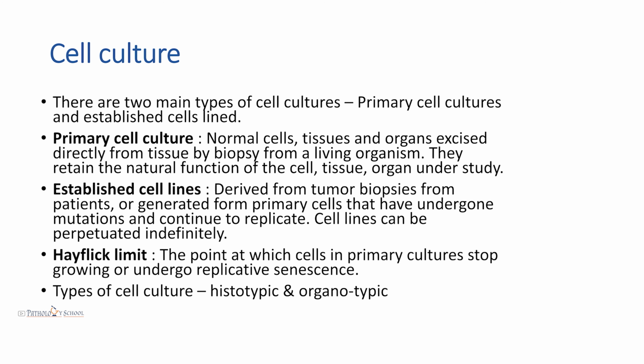In organotypic, three-dimensional production of the organ is tried. So the substrate will be more three-dimensional. Only one layer of the substrate is not used, and perfusion through exogenous substances is tried for those organotypic cell cultures.